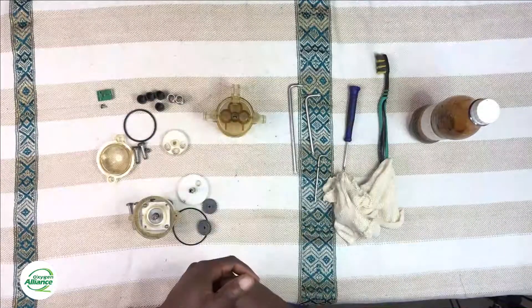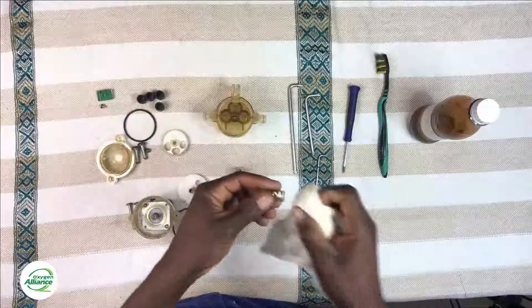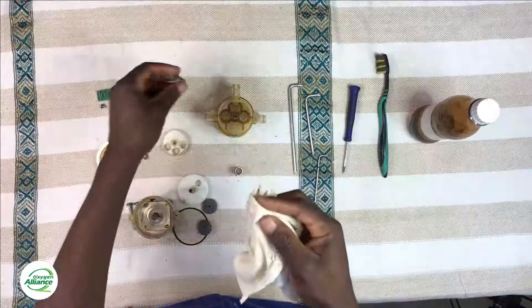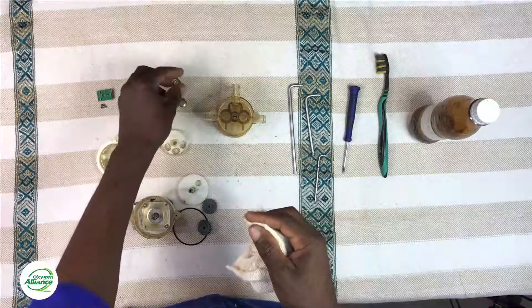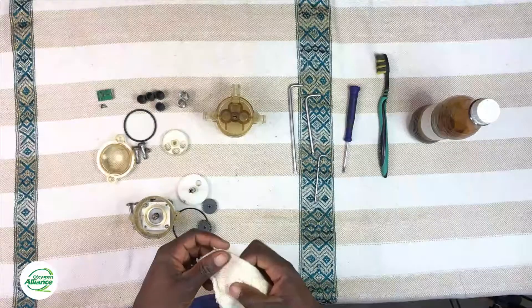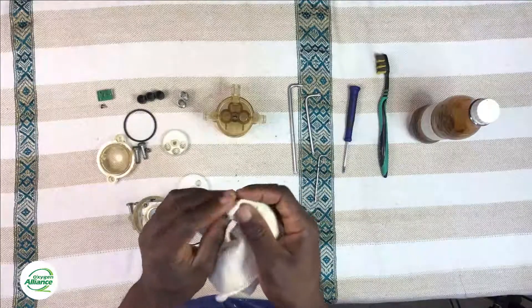After cleaning the housing, move on to cleaning the springs. It doesn't matter which order you clean them, as long as all the components are cleaned up. Once you clean the springs, move on to cleaning the rest of the other components — make sure that everything is nicely cleaned up.